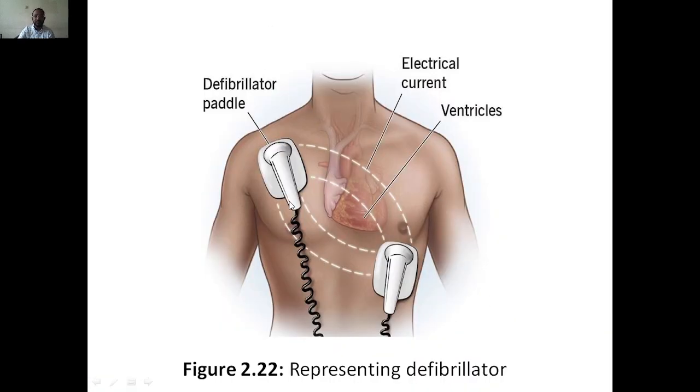So this is what you are going to give. One from the upper part, one from the down part. So here upper part, down part, it will create this kind of shock waves. One will be given almost at the atrium place, where exactly the atrium is, and another one wherever the ventricles are. So once they receive the electrical signal from external, then they will start beating, okay.